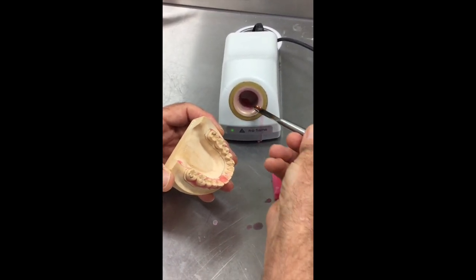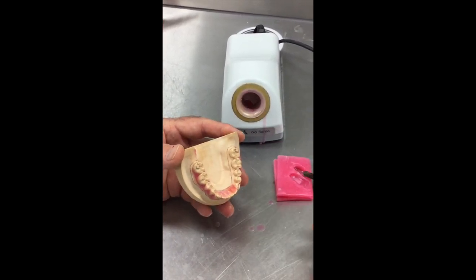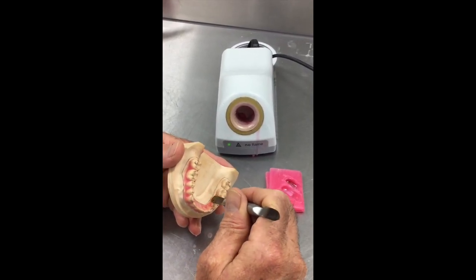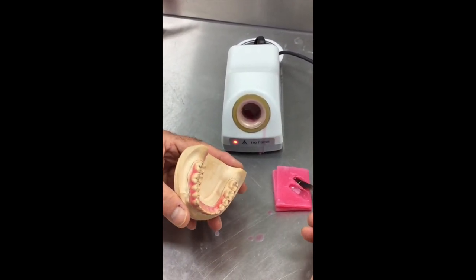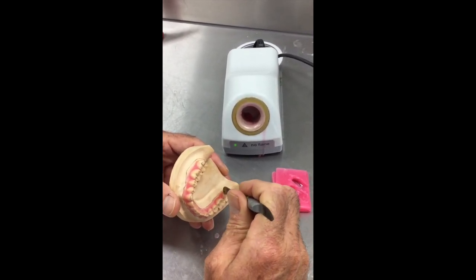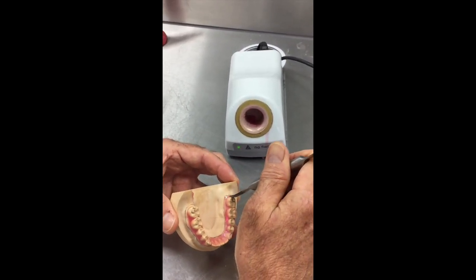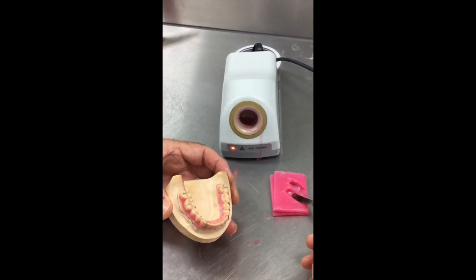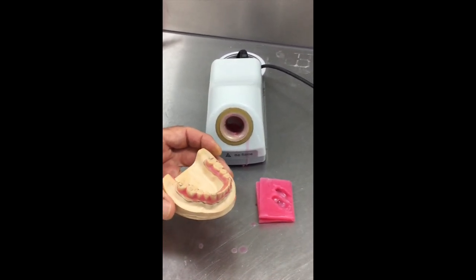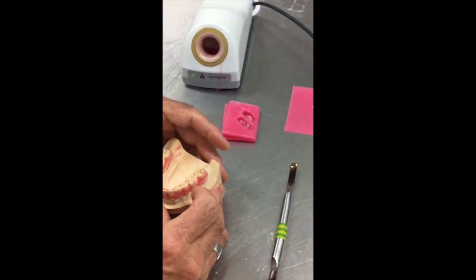This method that I'm teaching is one that can be used by people who have very little experience at creating special trays, and they can end up with a very good result, leading to consistent results with impression taking. Okay, so now we can see that I've just filled the undercuts like that in the proximal areas.